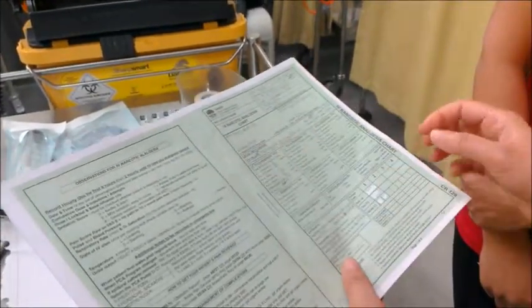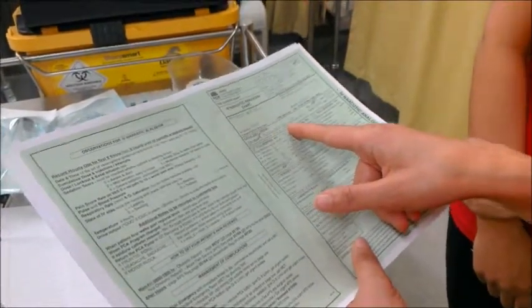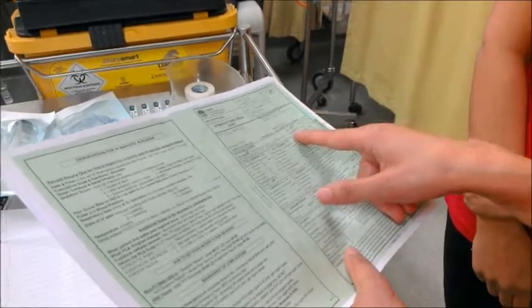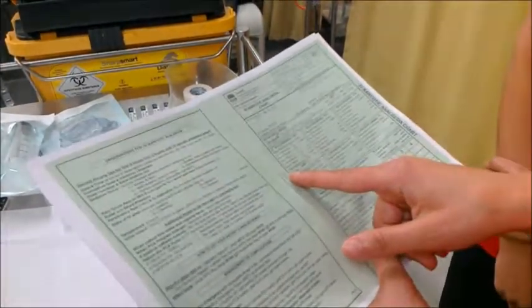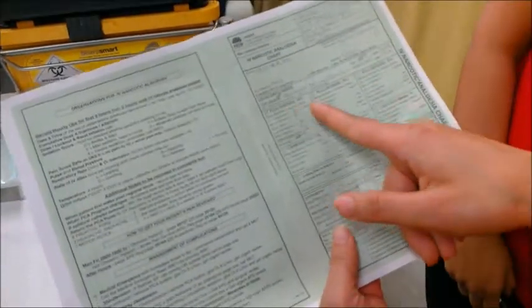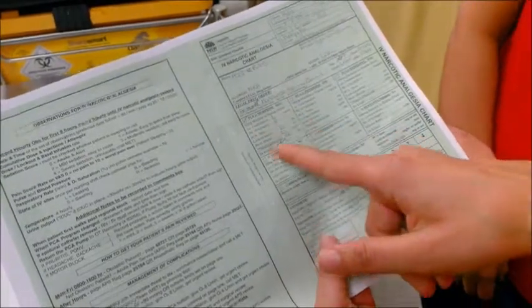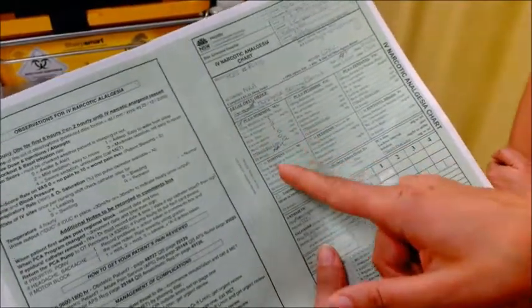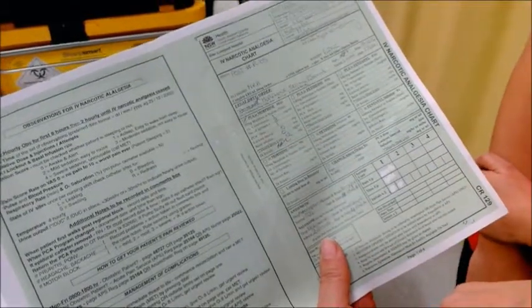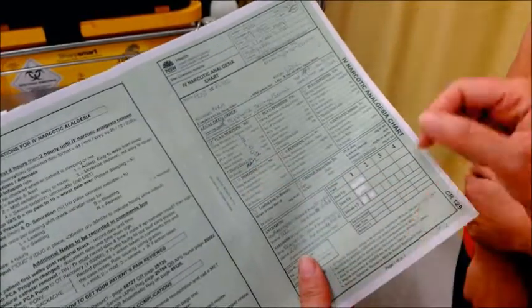It's been written here. Today she's been prescribed morphine 50 mg in 50 ml, signed by the doctor, dated, with the doctor's name here. The details are: 50 mg morphine in normal saline 50 ml, concentration is 1 milligram per ml, number of syringes is 3, PCA dose is 1 milligram, lockout interval is 5 minutes, basal infusion is 0, hourly dose is 12 milligrams, and here's the doctor's signature.